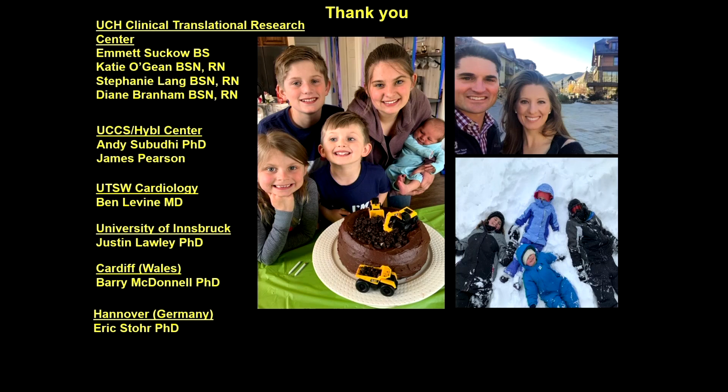This is a subject that I have had many conversations with the company that makes these. Cardiologists want an answer now. We can put a Swan-Ganz catheter in and know immediately what the hemodynamic pressures are, and we also know what the numbers mean. If I were to say that somebody's preload recruitable stroke work was 7, there's probably 2% of people in America that would have any idea what that even means.